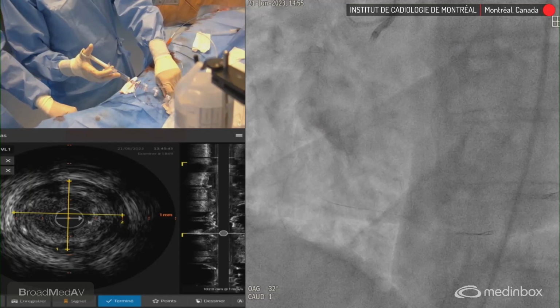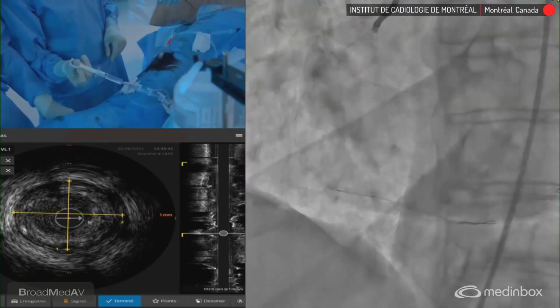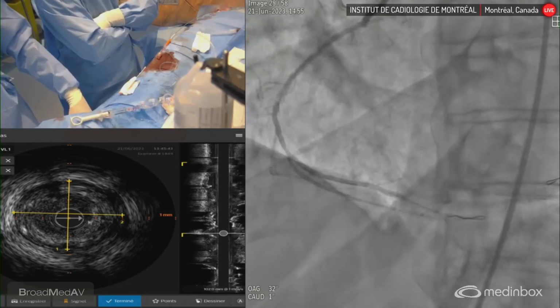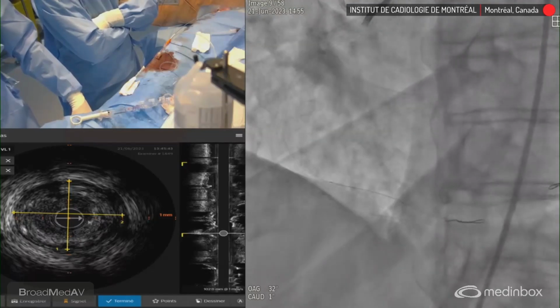Pressure is fine. The risk, of course, if you try to inject antegrade, is to promote and push a hematoma in the arterial wall. This would be, of course, a significant issue. But at this point, I think the vessel is actually good enough for us to assess and try to start to do stenting.